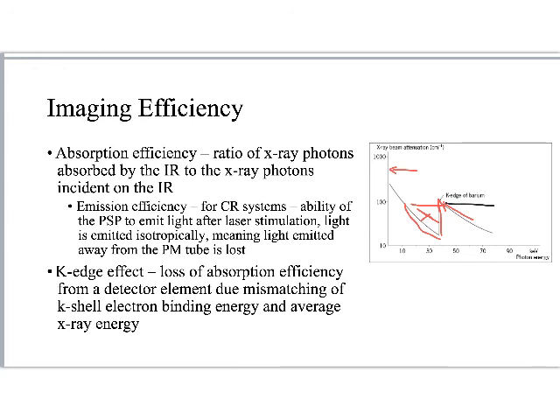Now, there are other K-edge effects, and there are other ways that characteristic effects play a part in X-ray imaging systems, but this is a primary way that we're concerned with it, this K-edge effect that occurs at the image receptor. Hopefully this was helpful. I know that some of this stuff is quite in depth.